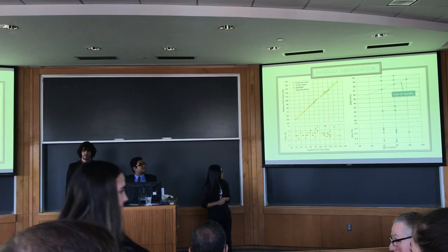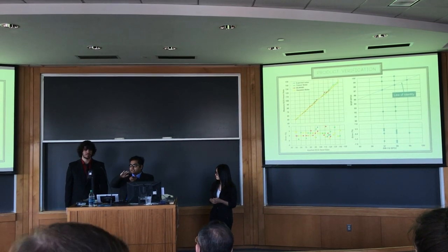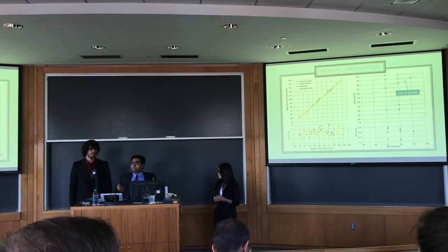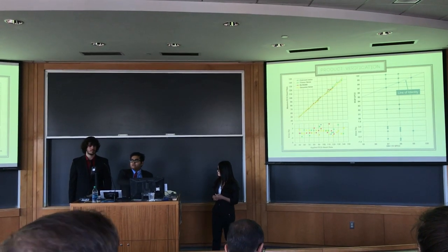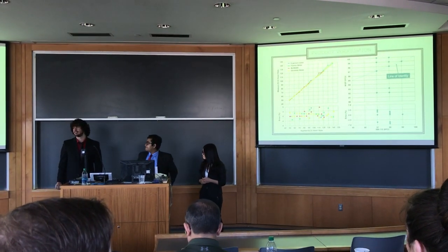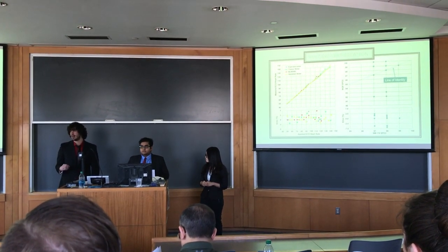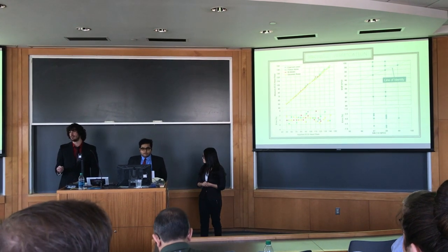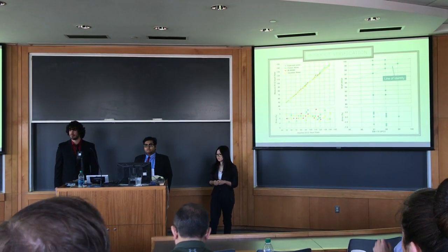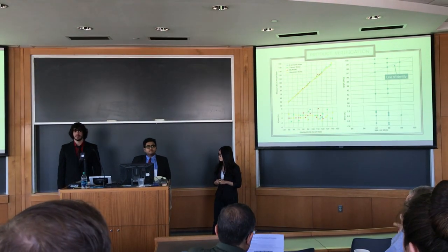And also, these pulse oximeters really depend on the light in front of it. So there's a ratio that you calculate from this, and then there's a heuristic algorithm that goes behind this, going from this R to the blood oxygen level down to clinical questions. You'll also, in theory, see a change in heart rate if the SpO2 does drop too low and it's not detected by our device. A doctor would know immediately that it was the SpO2, but they could check with more sophisticated equipment if that were a problem. Okay. So the fact that you're getting multiple data streams will allow you to probably verify it. I think we need to move on.